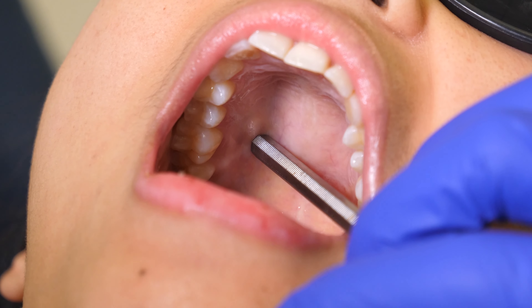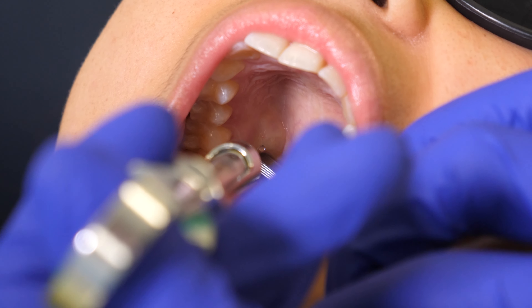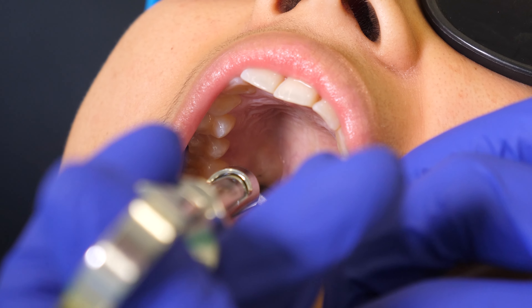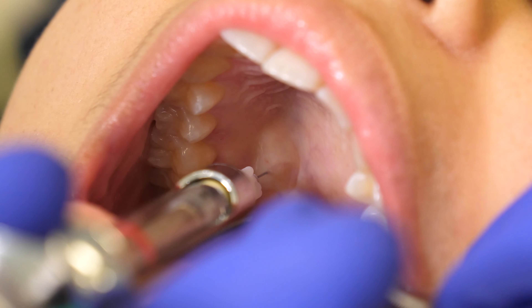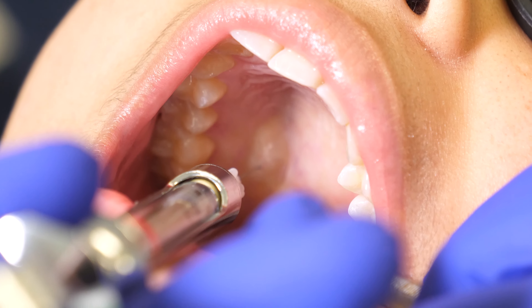For increased patient comfort, it is helpful to apply pressure with the end of a mirror at the injection site for 1 minute prior to administering anesthesia. For an adult patient, you should deposit 0.6 milliliters, or about one-third of a cartridge. Blanching of tissue is expected.